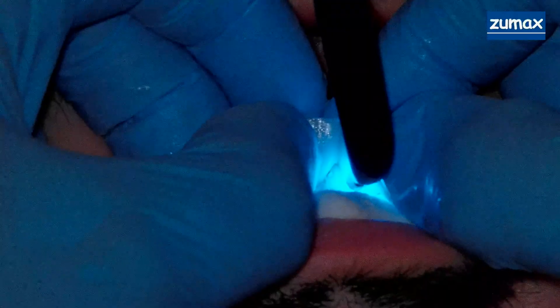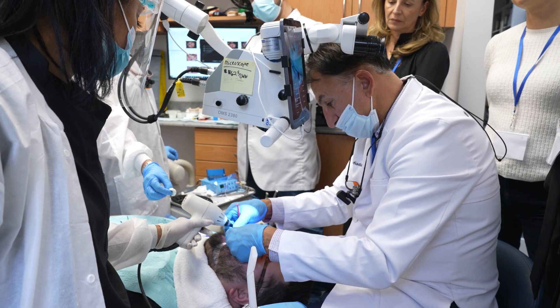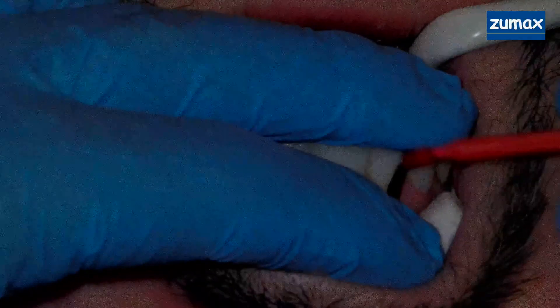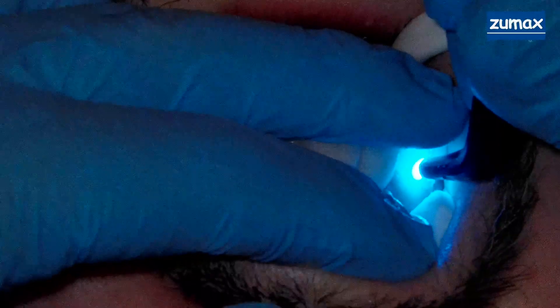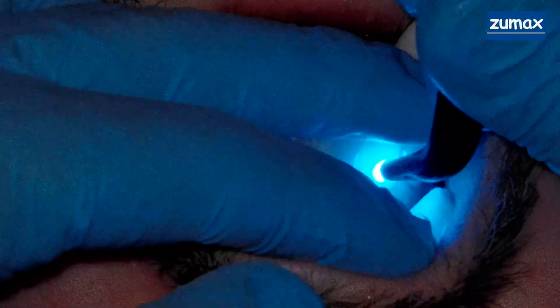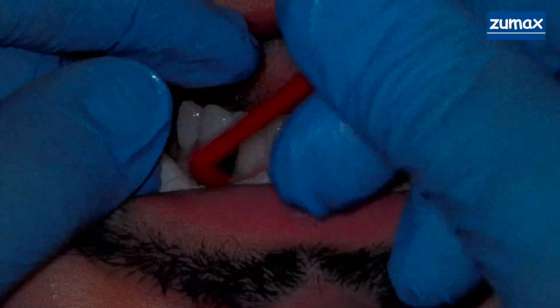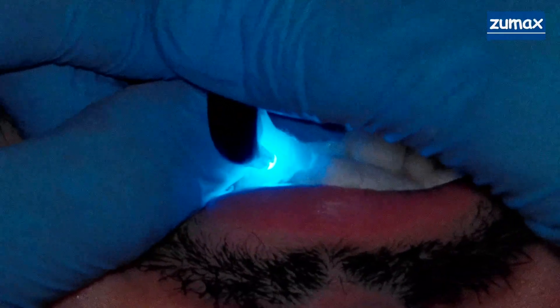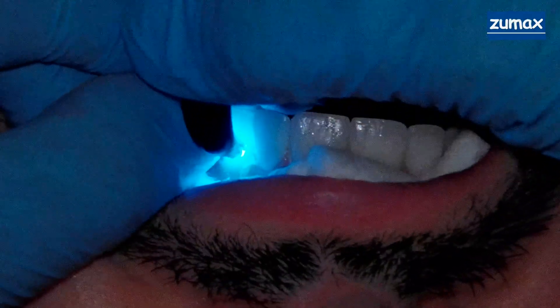Hold it. Wait for me. Go ahead and hit it. Can you guys see that? Hit it. Number 10 — in position, go. Number 11.